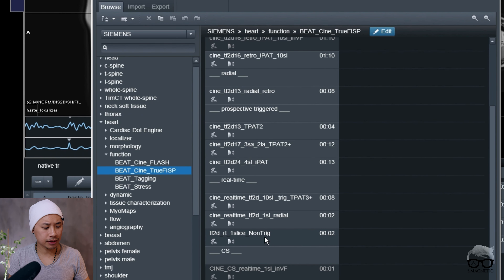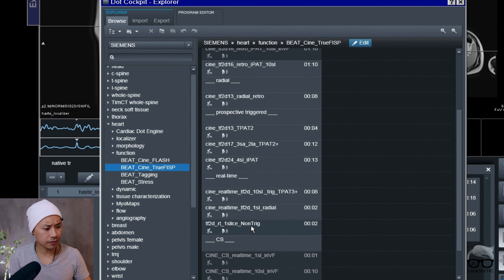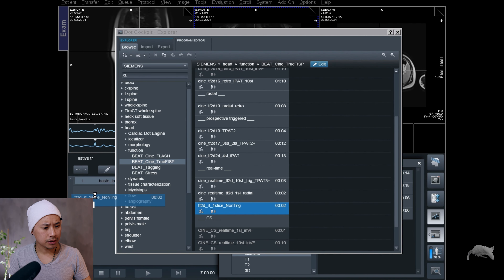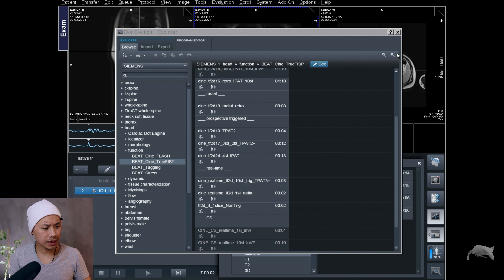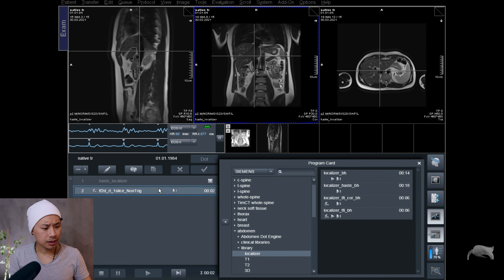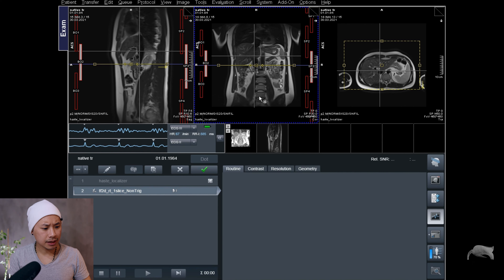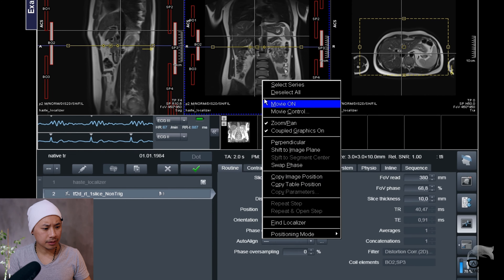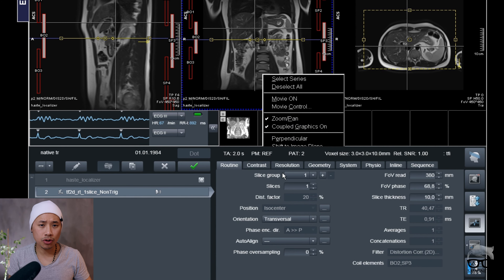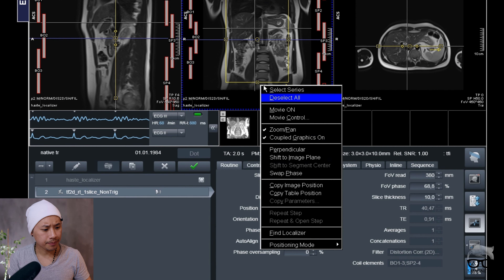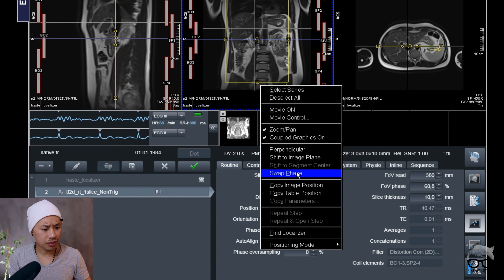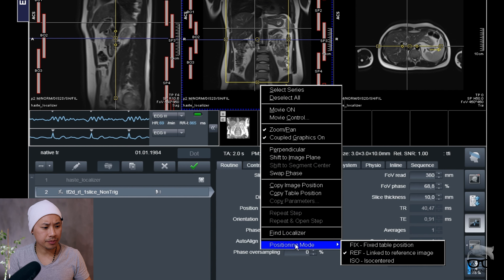In the exam browser, go into the Heart, then go into Function, TrueFISP, and at the bottom you'll find the one-slice non-triggered sequence. This is the one you can use — just drag it over.